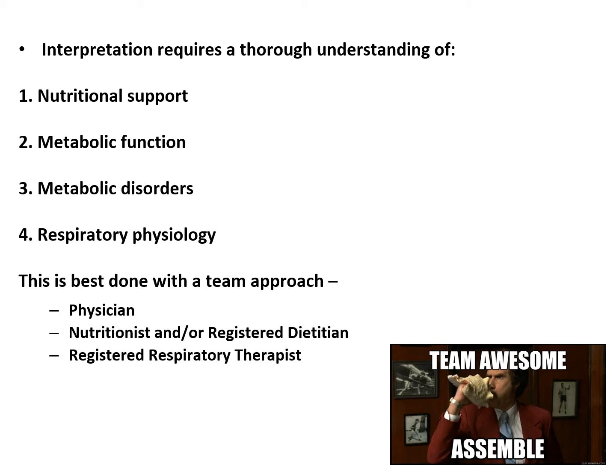Like I said, I'm not sure if I told you guys this before, but when I worked in Madison, Wisconsin years ago, they actually did this on all their TLC patients in the Trauma Life Center. They had a canister that was attached to the expiratory part of the ventilator. That's where all the exhaled gases went. It was like this aluminum canister that was actually mounted on the vent.